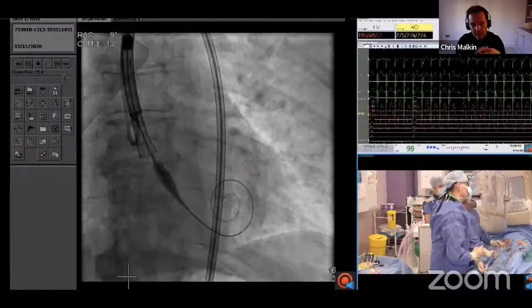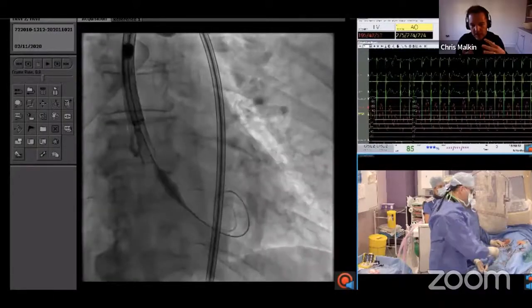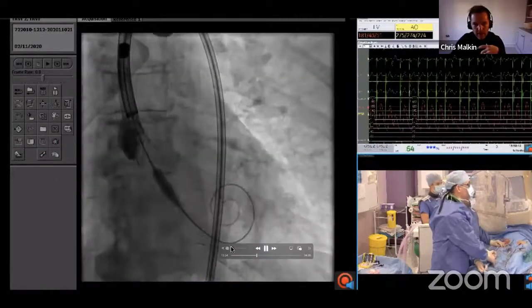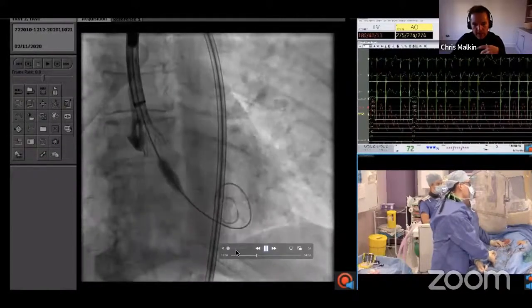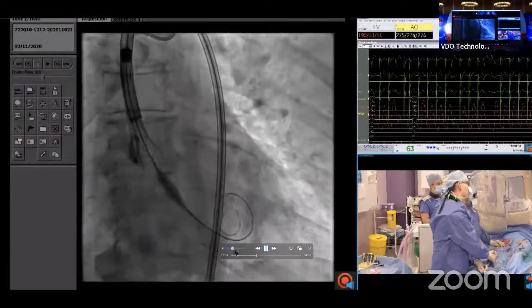But actually, see, when I do a picture here, you can see that actually the valve is perfectly placed 2-3 millimeters below. We're going to go for it now. And we'll do a period of moderately fast pacing to get it.